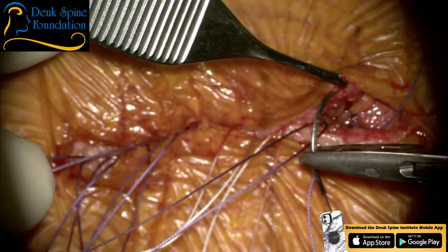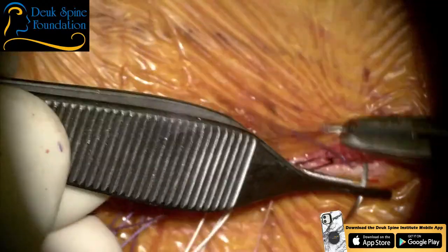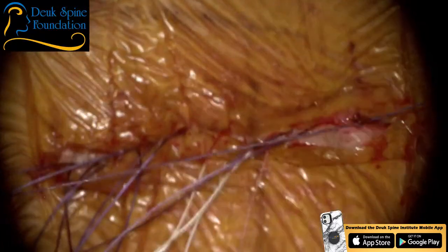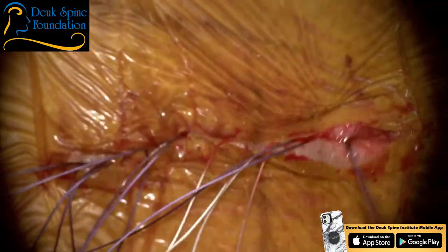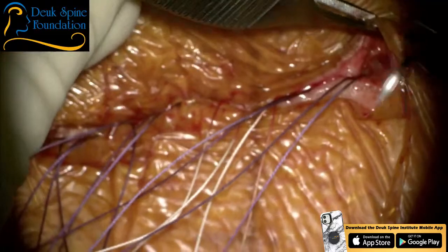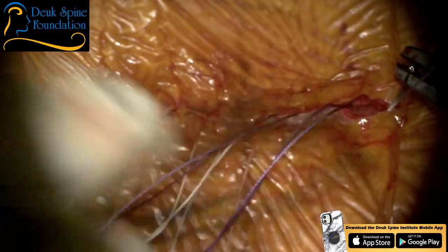You like this one skin too, sir? I don't understand what you're saying. You like this type of suture and skin, right? Yeah. Okay, good. This is exactly what I want. Okay, except they have an undyed one. Yes, that's what I'm saying. That's what I've asked for before. It's an undyed 10-pack or whatever, however many come in this pack. It's a pop-off, and it's the same needle. That's the best.